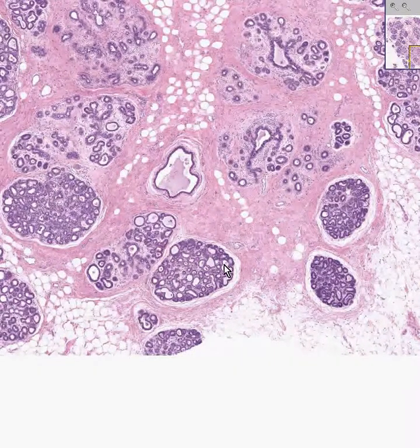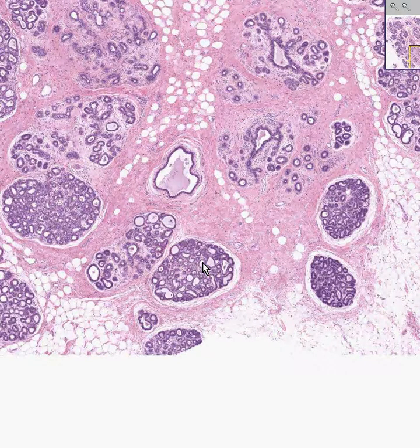Here are the distended alveoli. The alveoli still have the myoepithelial cells at the periphery of them. Sometimes alveoli are also called acini. Here is loose connective tissue under the influence of estrogen supporting these delicate lobules. And then here is denser connective tissue and some fat and more fat and a lot of fat composing the stroma.